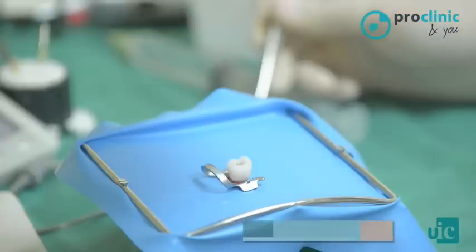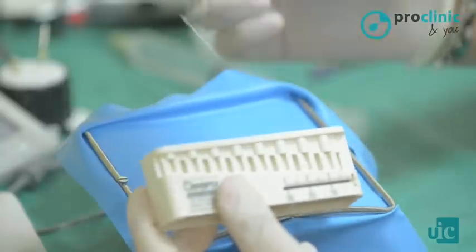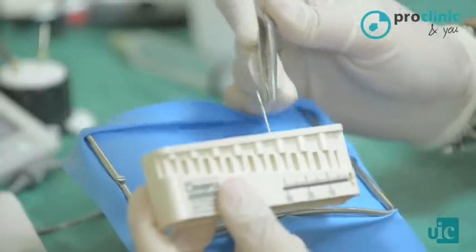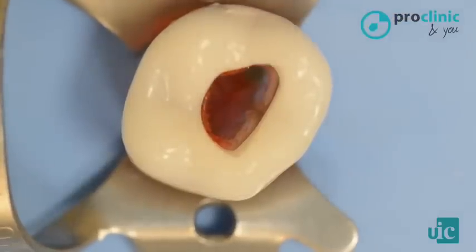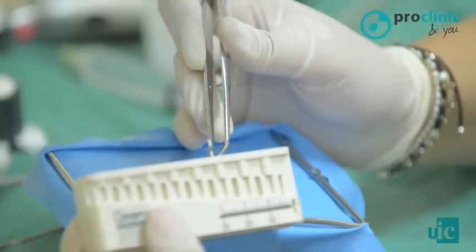After the final irrigation, we proceed to dry the canal with absorbent paper points of the same caliber and length as the file. We introduce them into the canal to check if the canal is dry. If not, we should repeat the procedure until it is completely dry.